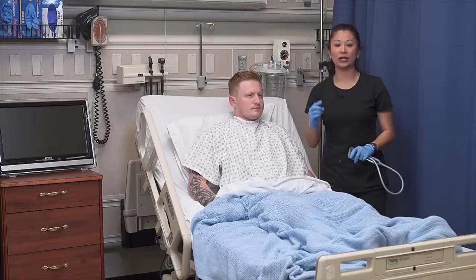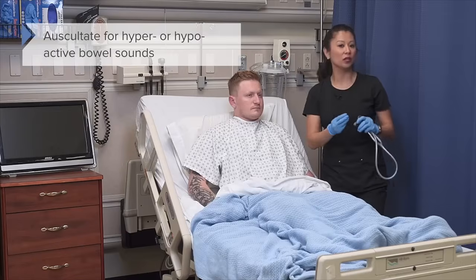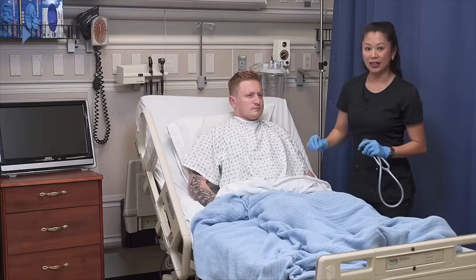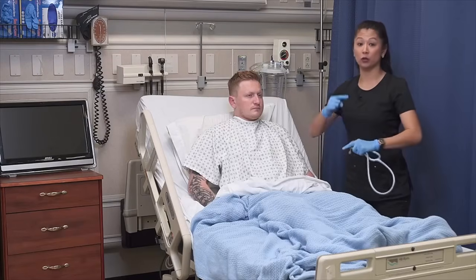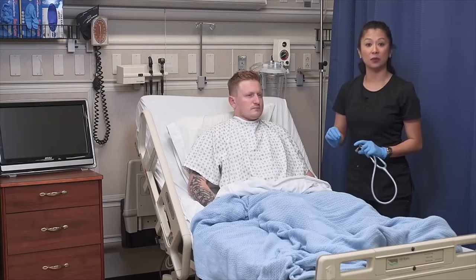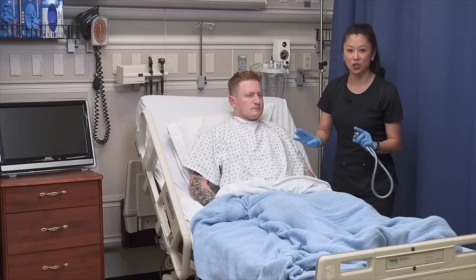Now we're going to take a look here. Does it sound really super gurgly and tumultuous? We call that hyperactive. Or does it sound very soft with a little bit of gurgling? We call that hypoactive. Now sometimes when we listen, if we can't hear anything, that's an abnormality and you definitely want to note that. We also want to know if you will hear any gurgling or anything high-pitched or any sort of whooshing sound. Anything like that you want to note and document in your assessment. Now just note, because everything's local, when I listen to Brandon's abdomen here, you may hear some of the heartbeat as well, and that's totally normal.